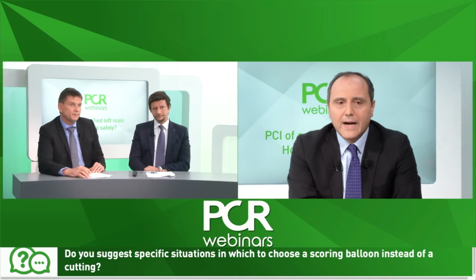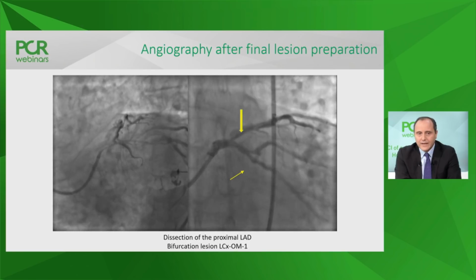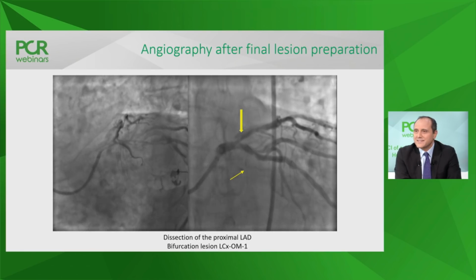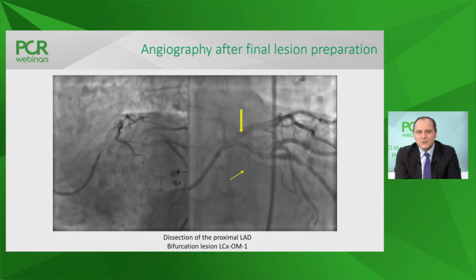no use for me. I need to show you now the angiographic result after this extensive plaque modification achieved with both rotational atherectomy up to 1.75 millimeter bar in both branches and with additional balloon dilatation. It looks like completely messed up, isn't it? What is your idea now, Chris? Do you need to do anything else before stenting?